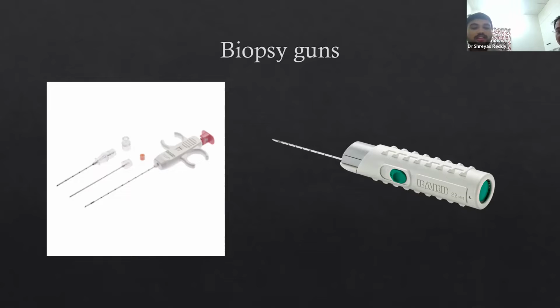Okay. So now suppose you are doing this biopsy and inadvertently injured the lung and the patient now has a pneumothorax. How will you go about caring for the patient? On table you have done a CT, you see a pneumothorax. What will you do? So the next intervention depends on the size of the pneumothorax. If it is a small pneumothorax, we can actually aspirate it while we are removing the needle itself. Small pneumothorax, you do not aspirate. Small pneumothorax, you observe for 6 hours.